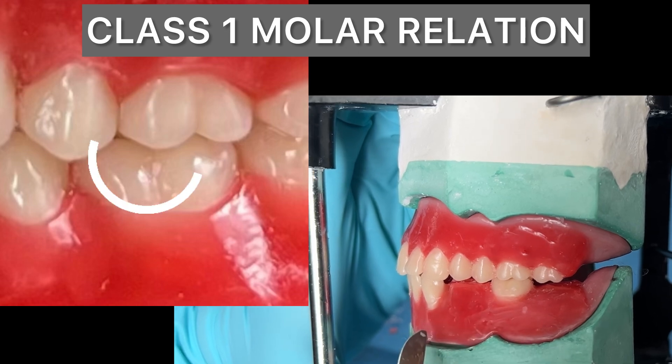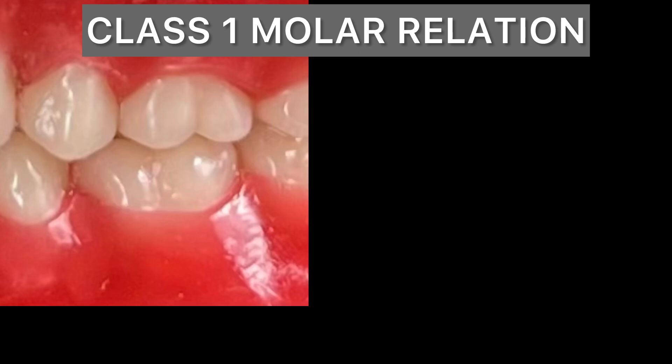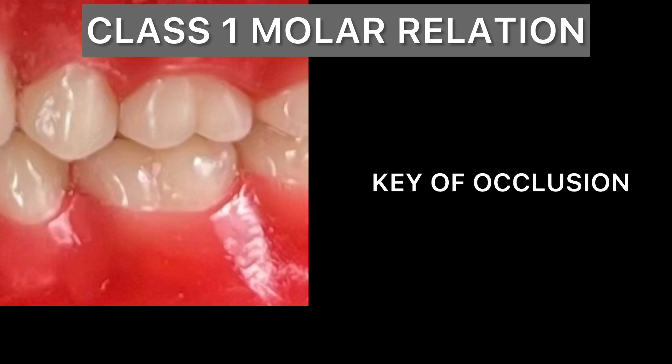Do spend some time to get this Class 1 molar relation absolutely correct. This is also called the key of occlusion.